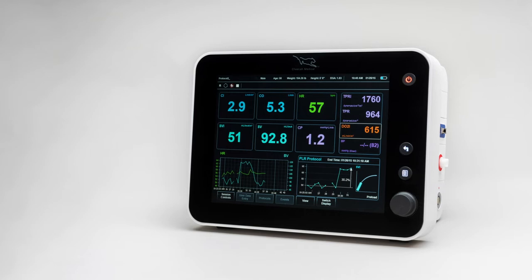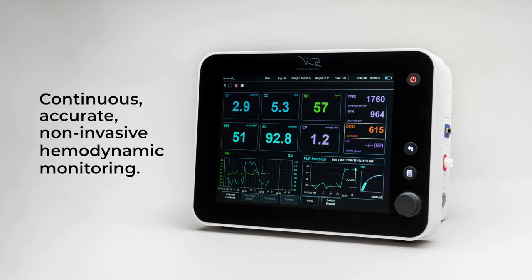The Cheetah Starling SV provides continuous, accurate, non-invasive hemodynamic monitoring and empowers fluid management across the continuum of care.